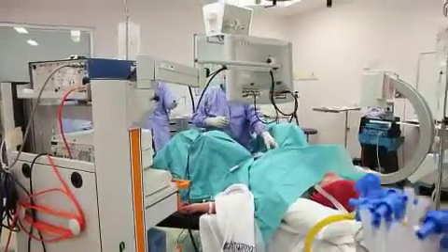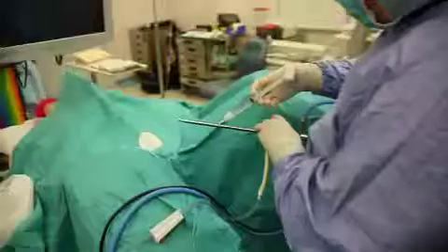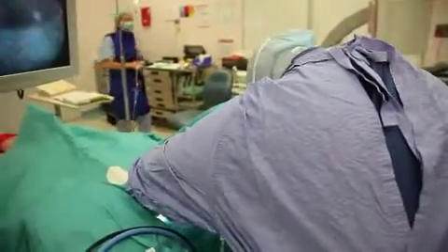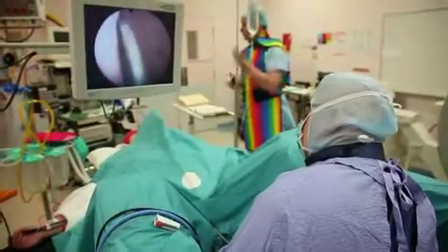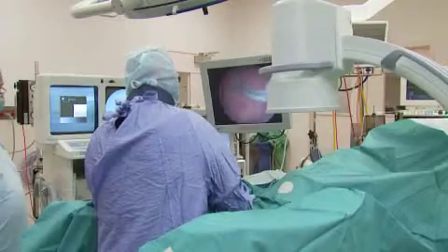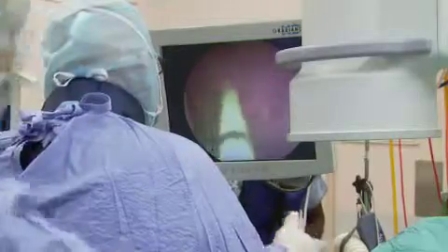As you can see, we are preparing now for the procedure. The cystoscopy is done first. We will use normal saline as part of the irrigation fluid, and we will get the II into place. Now you can see me doing the cystoscopy, and we have identified the ureteric stent. We have grasped the stent, and we have removed the stent.